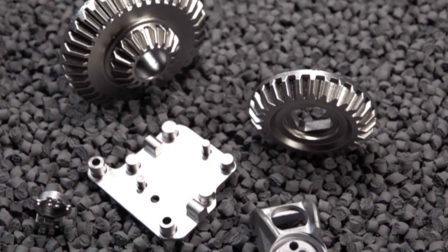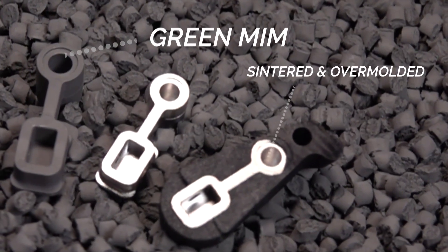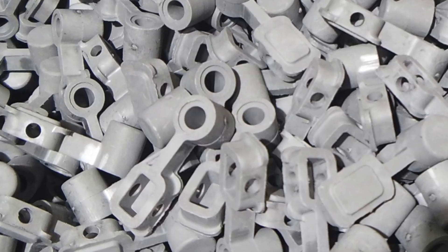At Ash Industries, one of the tools we use is a well-equipped clean room to manufacture parts that are critical to medical components. We control the particulate count so that the parts we deliver to customers are ready for assembly or immediately ready for sterilization.